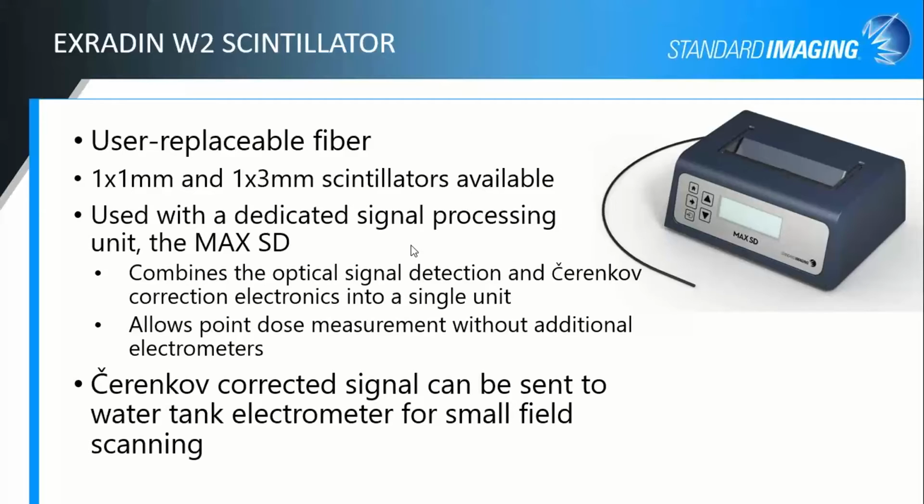There is a rectangular field method you can use for the CLR characterization where you have it in the scanning orientation and just use something like, say, a 2x20 field, and you have it coming in from the side of the long skinny field for the minimum fiber configuration, rotate your collimator to get the maximum fiber configuration, and you can do that just in the scanning orientation if you don't have a vertical diode holder for your Sun 3D tank. Good question though.